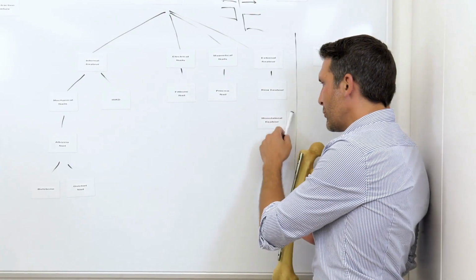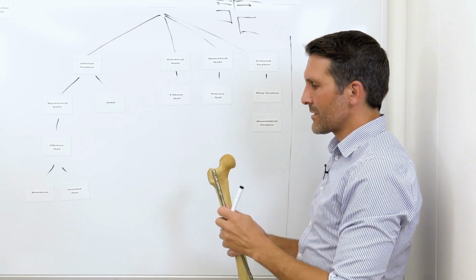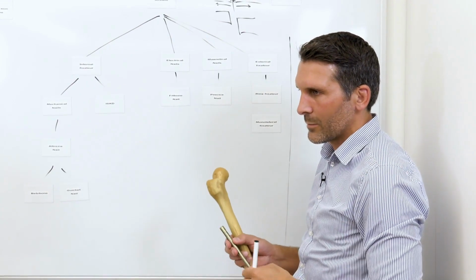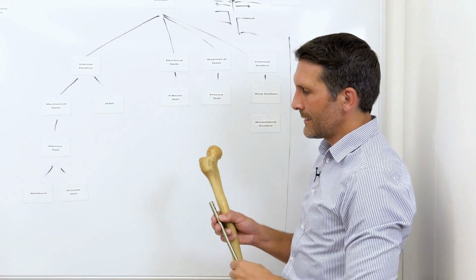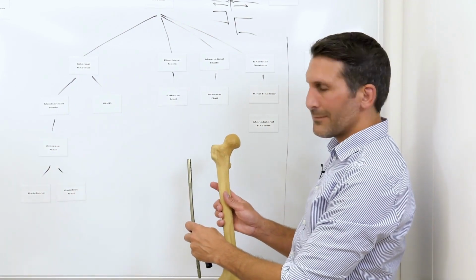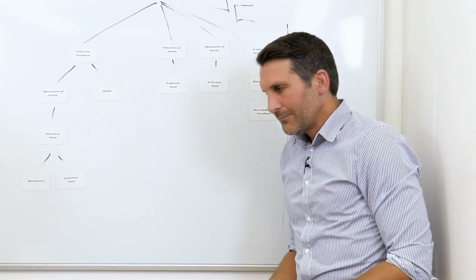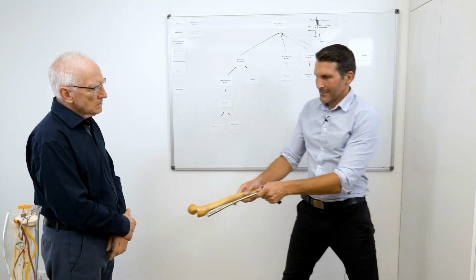Just using a unilateral fixator that is basically stabilizing from the outside would be nothing more than a system on one side that is secured to the bone with screws, which is practically not possible. And why is it not possible?